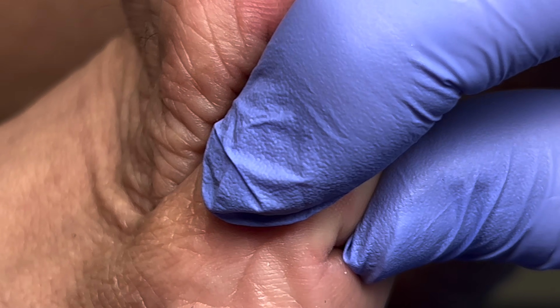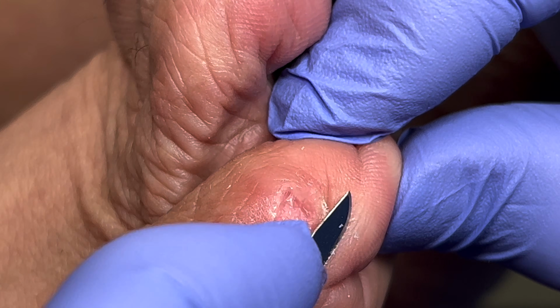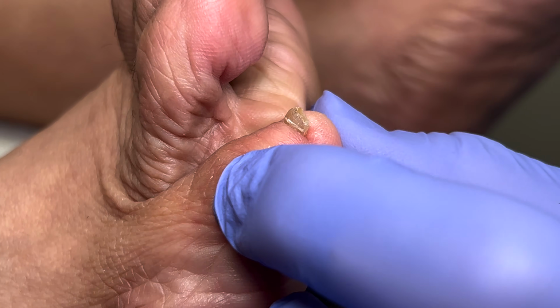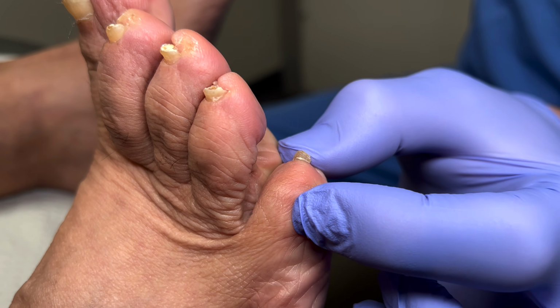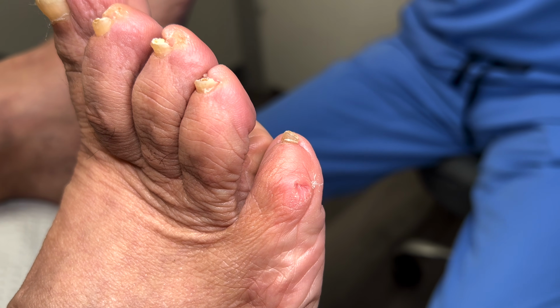That should feel a whole lot better. Obviously, you guys are over there, I'm over here, but I'll tell you this much. When I press on this right here, I feel bone right there. And that bone is sort of begging us, shave me down. Just like they shaved my hair.